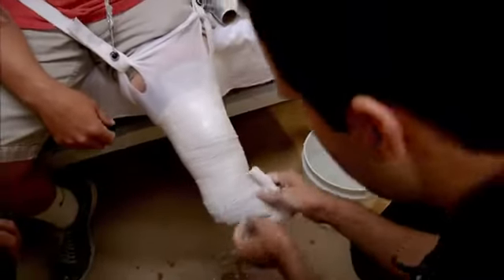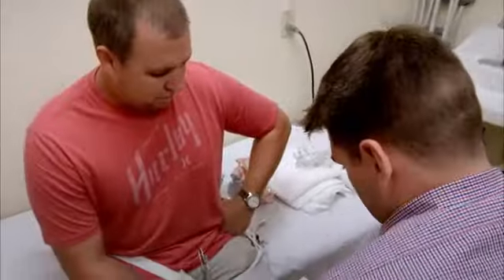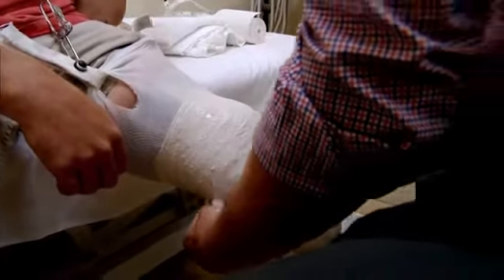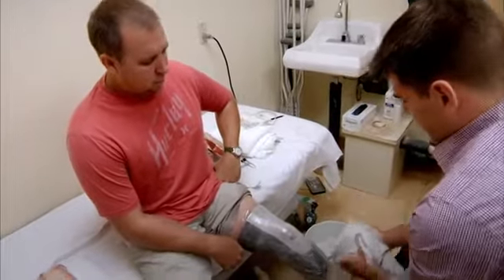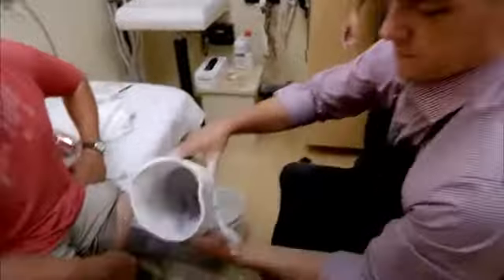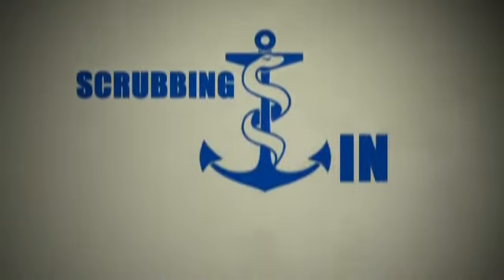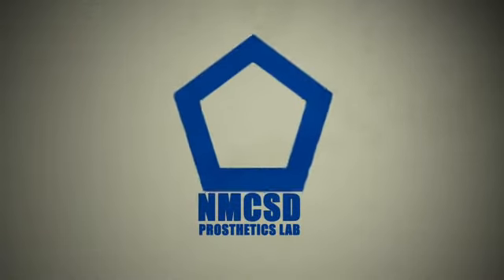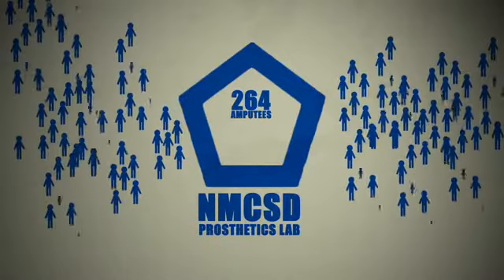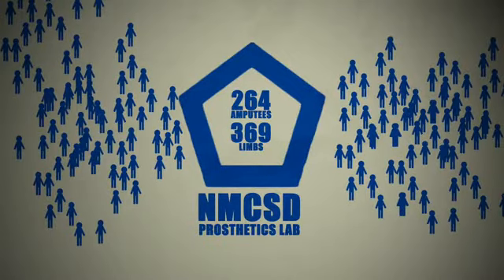Brian showed me the technique for making a cast, and I applied it to Nate, who was a great sport. The prosthetics lab at Naval Medical Center San Diego treated 264 amputees last year with a combined 369 limbs lost. These amputees were made up of active duty service members, their families, and retirees.